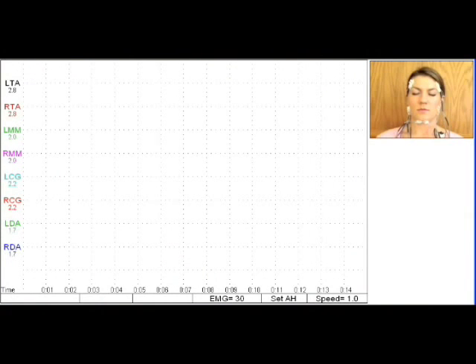Ask the patient to relax their jaw. If you have the patient close their eyes, you will usually get lower EMG readings for most people.